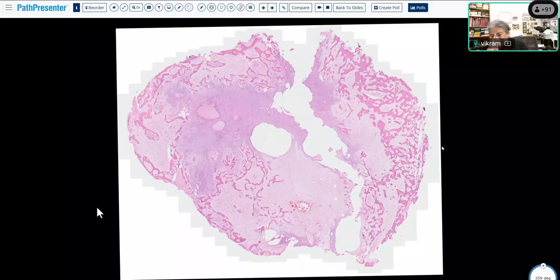Yes. So somebody asked me for location. I have a good colleague of mine who says it is wherever you want it to be, right? And by that we mean some things are histologically so characteristic that you don't necessarily need a lot of clinical information.